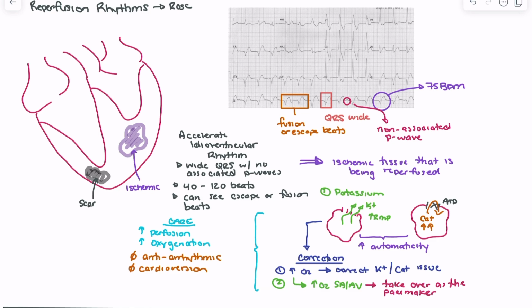One of the things you can start thinking about is how clinical presentation plays a role here. You're less likely to see these rhythms in someone who is having a massive STEMI, for example, who has extensive structural damage to the heart. If I have long-term cardiac ischemia or acute coronary syndrome, I have heart failure, I've had previous MIs, or I'm having a massive heart attack today, chances are that I am going to have lots of scar tissue, and I would use that clinical information to make some decisions about this patient if I'm not sure. If the rate is high and I'm not positive whether this is an accelerated idioventricular rhythm or a VTach, I will use some of that information to make this decision. But we want to be really mindful in a lot of these patients.